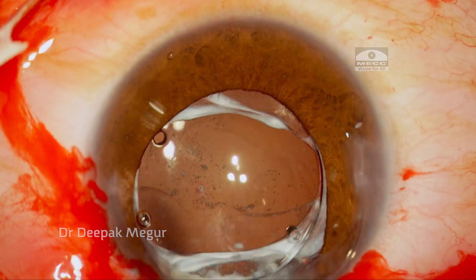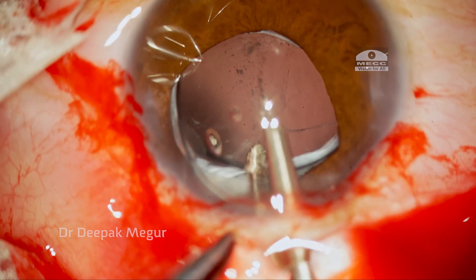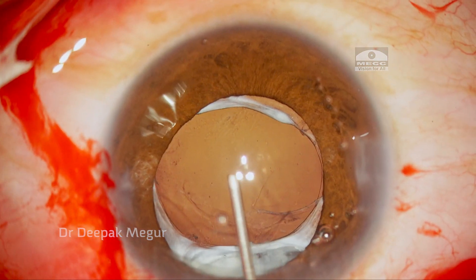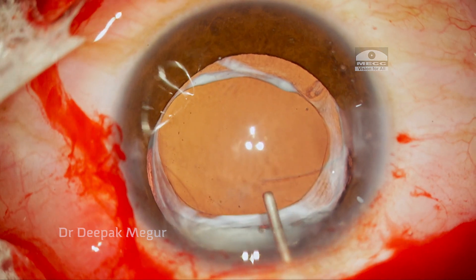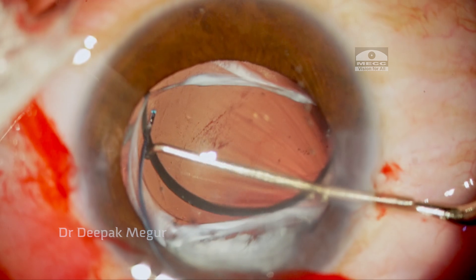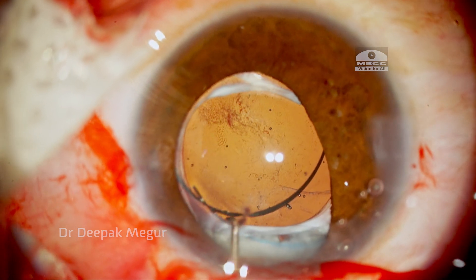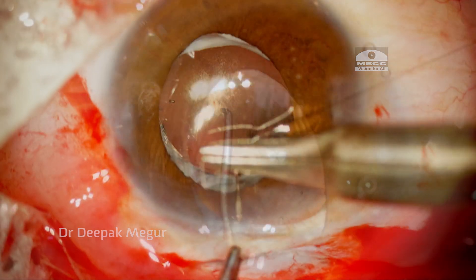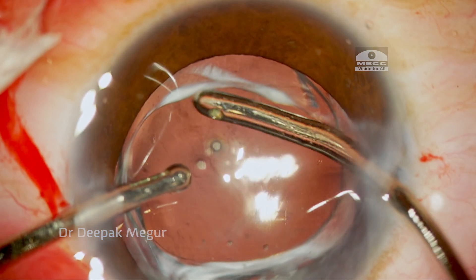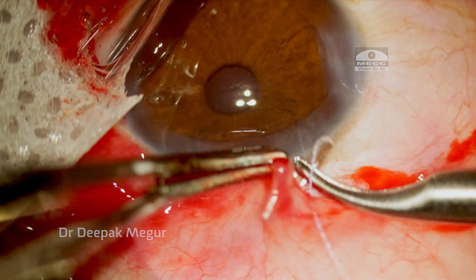I gently dialed one haptic out of the bag, then refilled with OVD. Using a forceps, the entire lens was explanted out. The new appropriately powered hydrophobic acrylic lens is then implanted into the bag. To counter the against-the-rule astigmatism, I am placing a single 10-0 nylon suture. OVD both in front of and behind the lens is aspirated out, and then the conjunctiva is closed using a Vicryl suture.